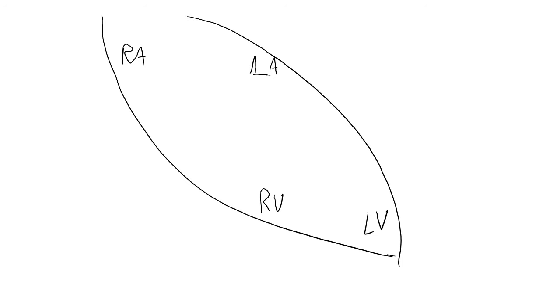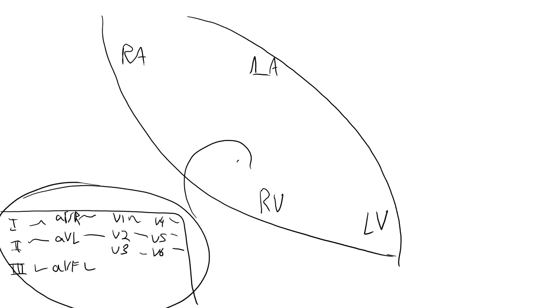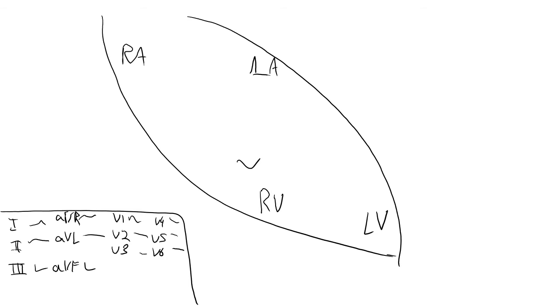So what do I mean by that? Basically, if you remember on the ECG lead, I'll just draw a little reference here. We have lead 1, lead 2, lead 3, if you can remember back to the picture that I showed you before. Then we have AVL, and AVF. Then we have V1, V2, V3, V4, V5, and V6, and they have their various waves represented across like that. I like to translate this data so that it's represented on the actual heart. So let's do that right now.